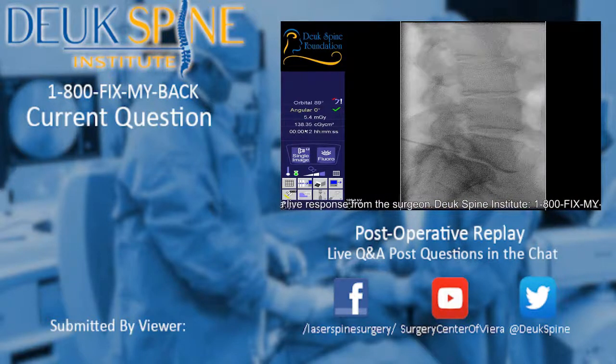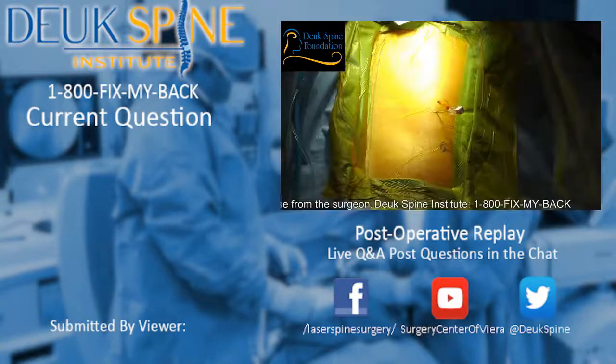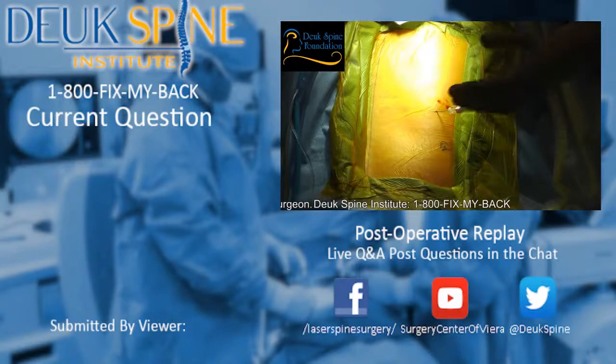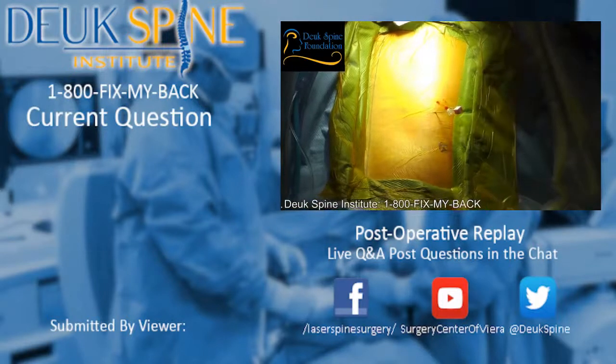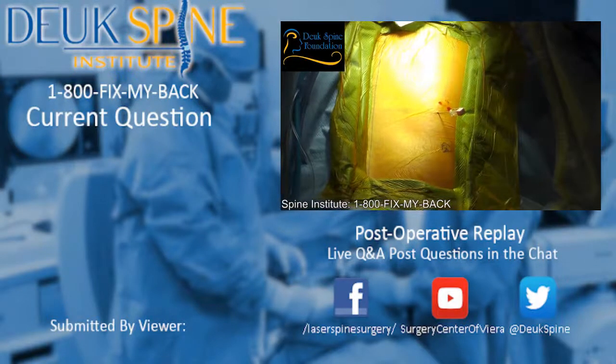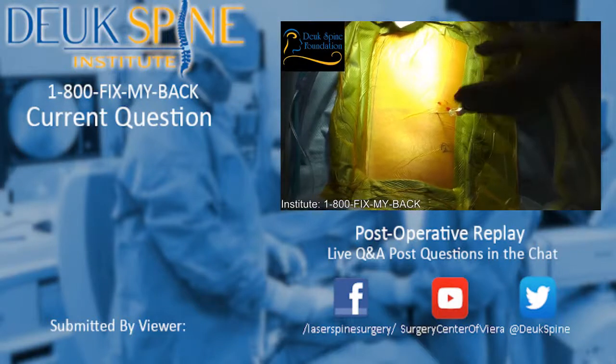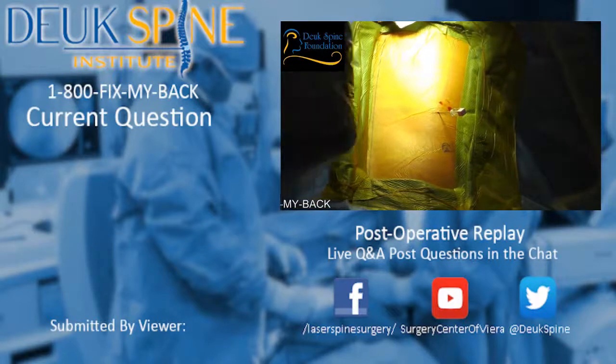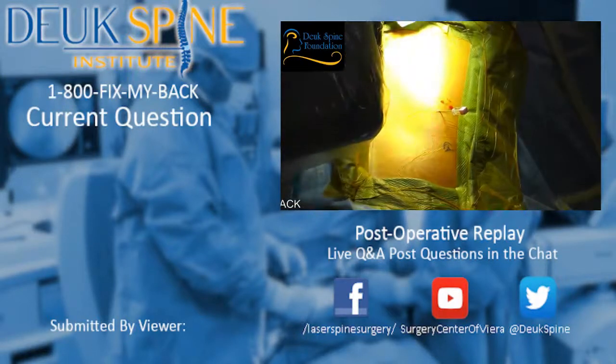If the patient has 2 painful discs, you have to do 2 disc annular debridement. If they have 3 painful discs in their back, you have to do all 3. Otherwise, they're still going to have pain from the disc that you don't treat. The only way to get rid of disc pain is 2 things. Number 1, Deuk Laser Disc Repair, debridement of the annular tear. Number 2, clean the whole disc out with shavers and then fuse the bones together.